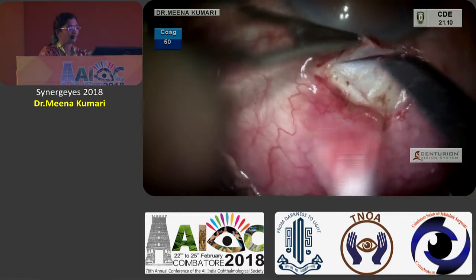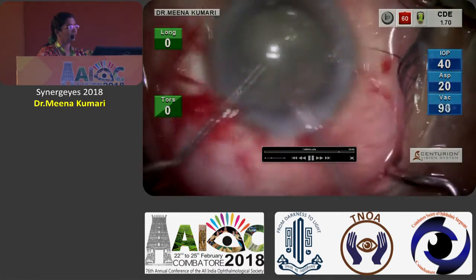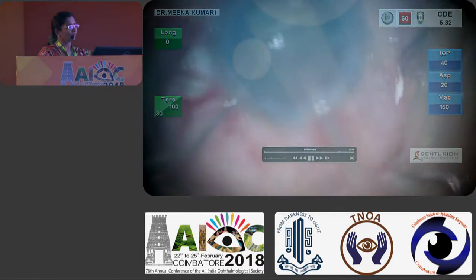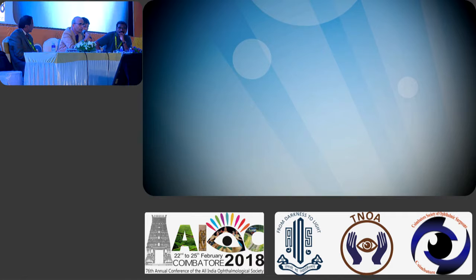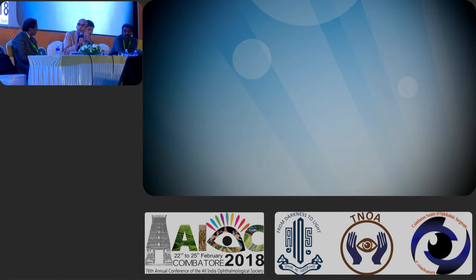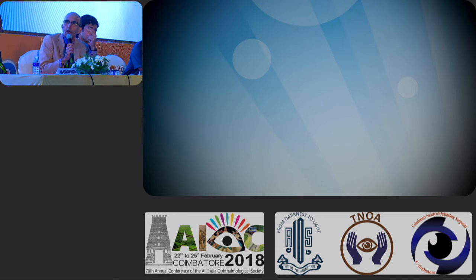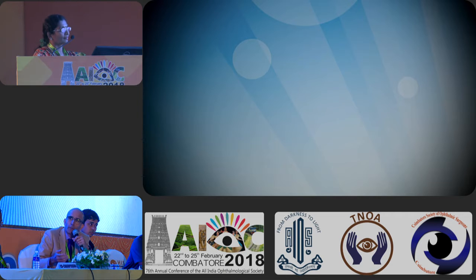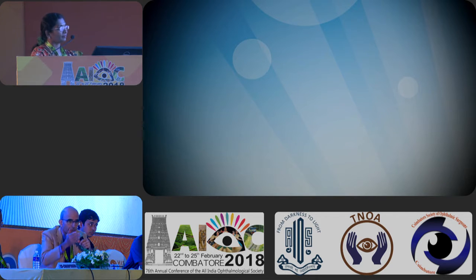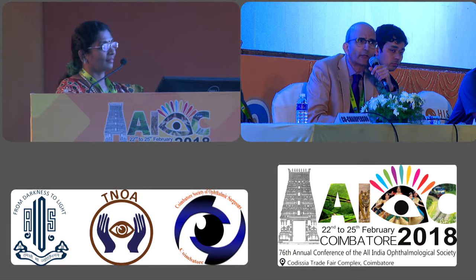Wonderful exhibition of demonstration and teaching. It's amazing that with this technology, you can deal with whatever scenario you have, and this has a unique energy delivery system in terms of OZil and also that balance tip that you mentioned so well. That has changed how the lens material will be positioned at the bevel, at the tip, for the next stage of its removal. So I think this technology has these unique components of energy fragmentation, the way it is the most desirable, and then this active fluidics you mentioned so well will take care of the stability of the chamber, and we saw all the videos, superb stability, but also it has such unique anti-surge mechanisms inside that surge has become history now.